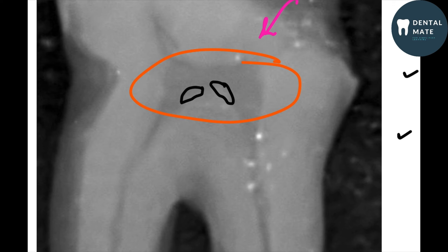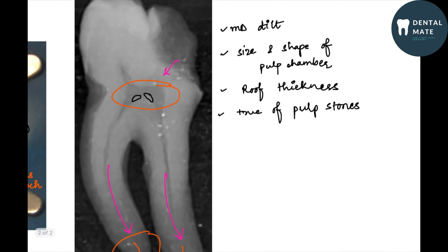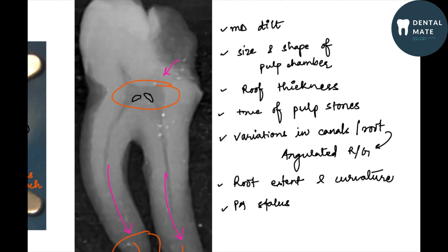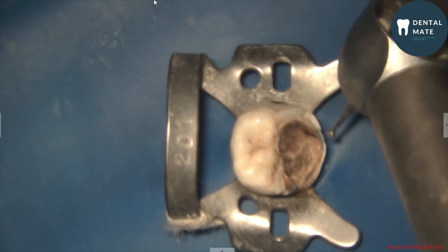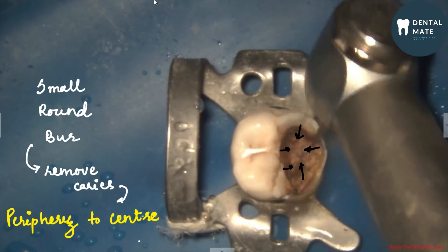If we carefully look at the floor, we can see certain ragged borders which indicate the presence of pulp stones. There are also variations in the canals of the root, for which we have to take an angulated radiograph. We can also see the extent and curvature of the root and the periapical status of the patient.